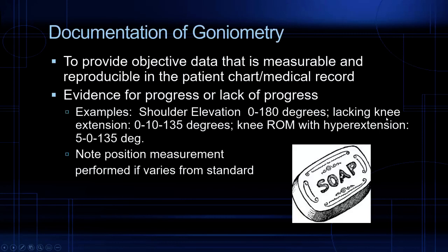Another kind of weird outlier in measuring is knee extension and also elbow. So knee range of motion, and elbow range of motion. These are two little weird outliers that you're going to want to make sure to know how your place of employment likes to measure them. And they're both okay.